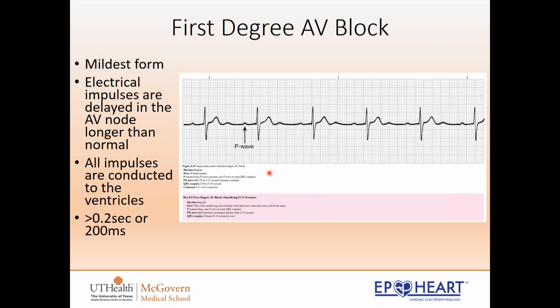But if the HV is longer and it takes a longer time to get through the His bundle, then that patient could potentially need a pacemaker in the future.